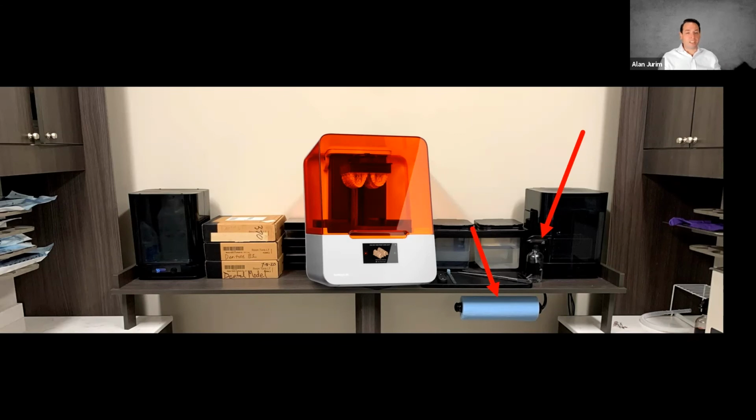So the simplest thing, which saved us so much time and effort in producing good results, is to just have paper towels and a rubbing alcohol container close by, so it's very easy to keep things clean. The cleaner you keep them, the more predictable the results.